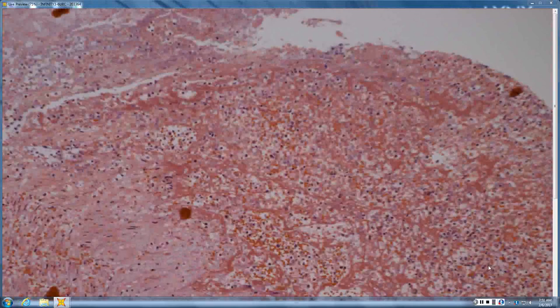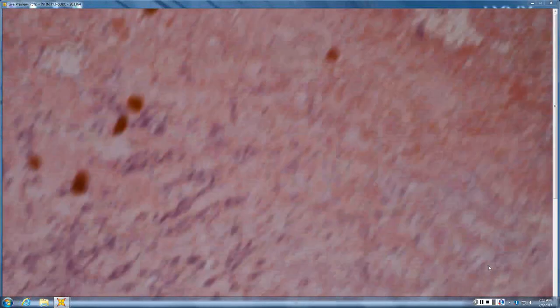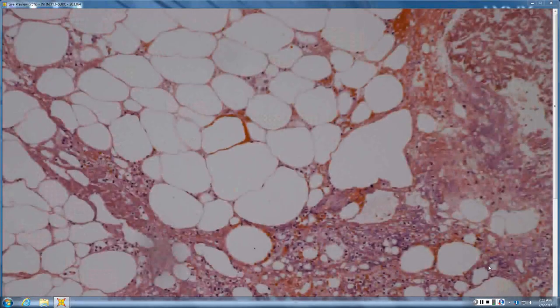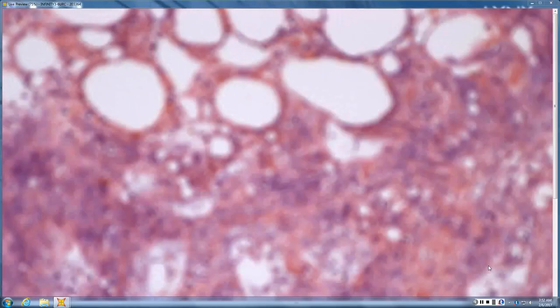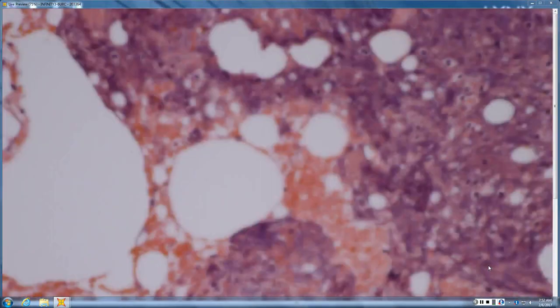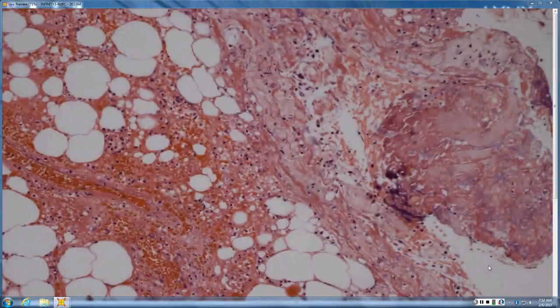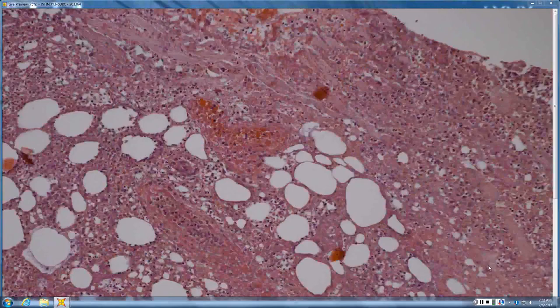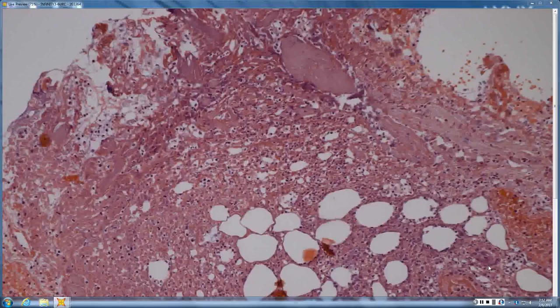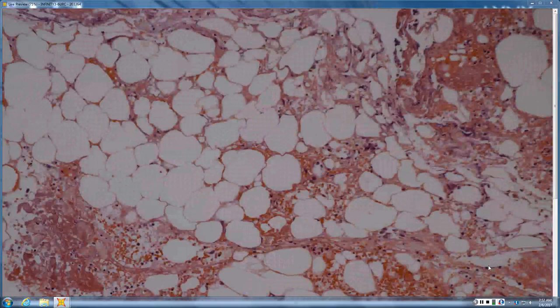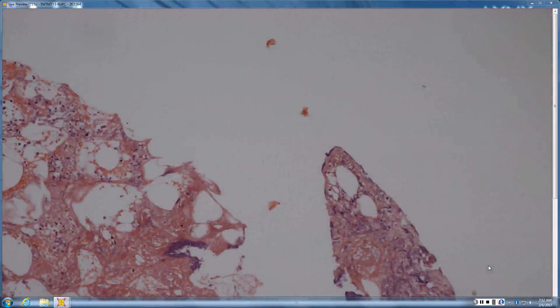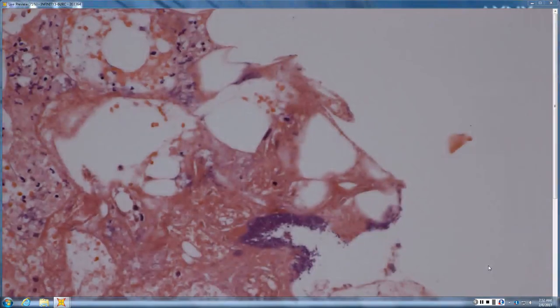So, I think I might be saying lots of little organisms about the size of other cells around. Yeah, we also have a lot of reactive fibroblasts. We want to make sure we're not mistaking any of that for organisms. There's a lot of amphiphilic background that may be bacterial debris. So, this may be a synergistic infection of some sort. Let's see if we can make out really good hyphae. A good place to look is dead vessels. Because they're what's killing the vessels. I think we're going to pass on this one just because we're not seeing enough of them to make them really stand out.